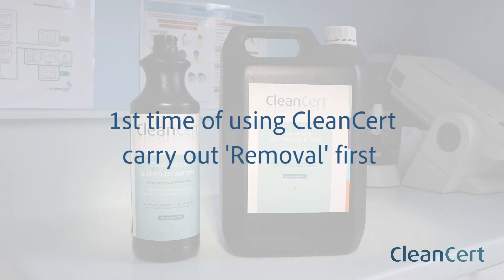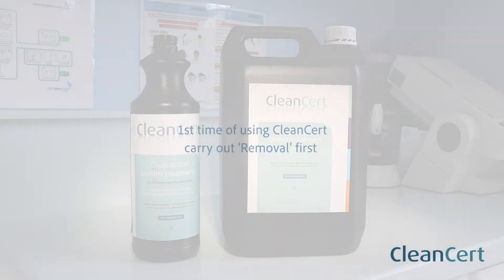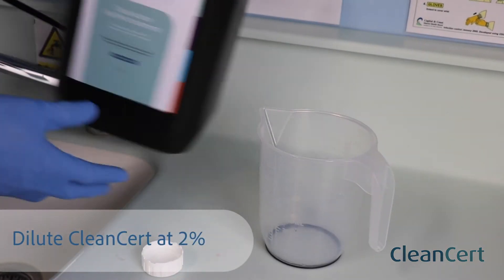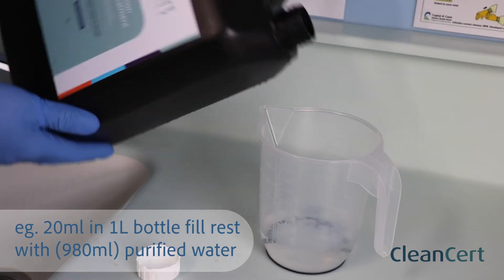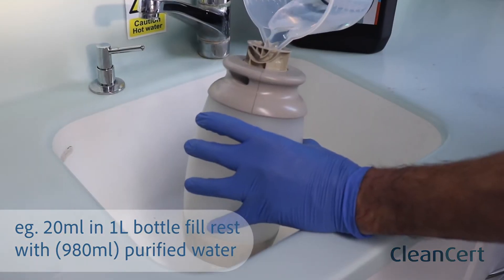On first time of using CleanCert, carry out the removal process first. Dilute CleanCert at 2%, e.g. 20 millilitres of CleanCert in one litre bottle, and fill the rest of the bottle with purified water.